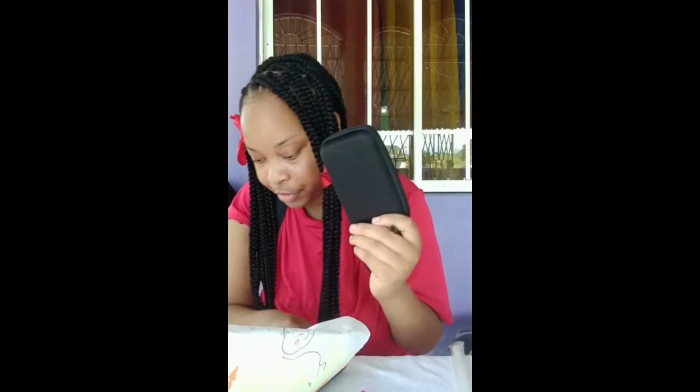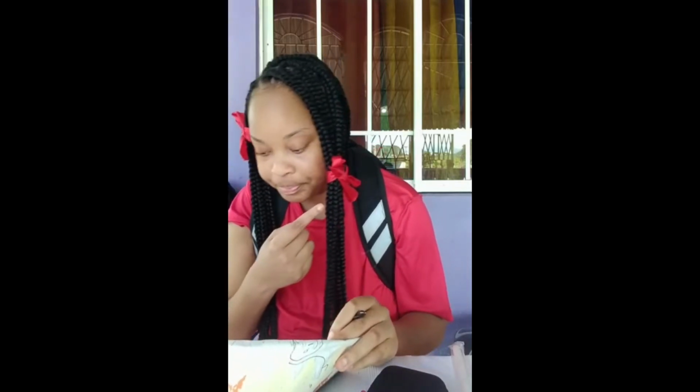Also note, for persons who are taking warfarin, your provider may recommend your test be regularly done at home, or you can use a PT or INR test kit, something like what I have here. During this test, you or your provider will use a small needle to puncture your fingertip, collect a drop of blood and place it onto a test strip or other specialized instrument, then place the instrument or test strip into a device that calculates the test results.